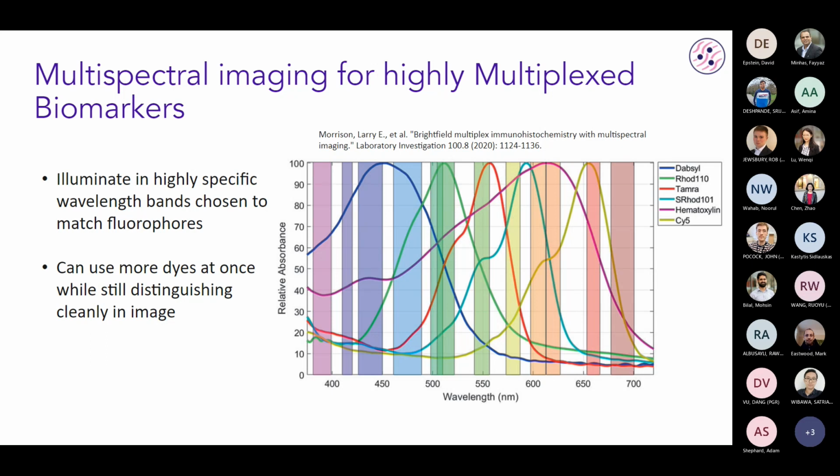I have one question. For example, in this case, we will get multi-channel image. In case of RGB, we are getting only 3 channels, but in this case, we will get multiple channels, right? Yeah, I'll explain a bit more about that in the next slide.